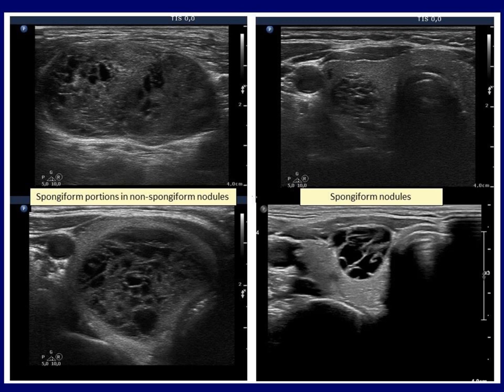Although small cystic chambers can be seen in most parts of the nodule, in contrast with the spongiform pattern, they are mixed with a solid part. In the right cases, the spongiform areas exceed 50% of the nodule, therefore these lesions can be classified as spongiform nodules in all but the European Thyroid Association guideline.